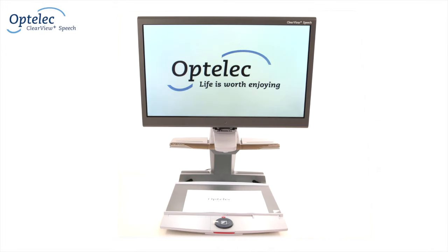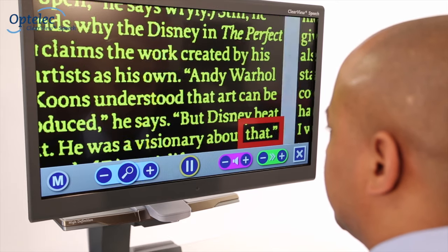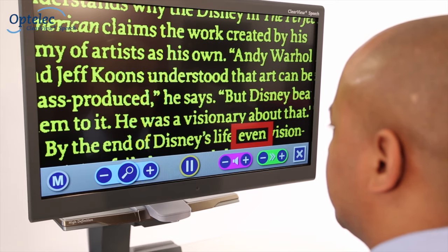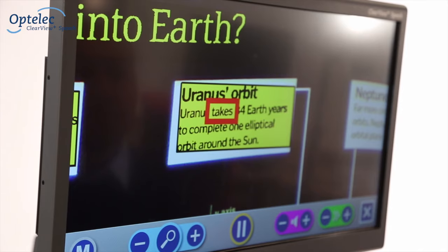The Optelec Clearview Plus Speech is an inventive and unique module for any existing Clearview Plus desktop video magnifier. It allows you to view, enlarge and listen to documents.